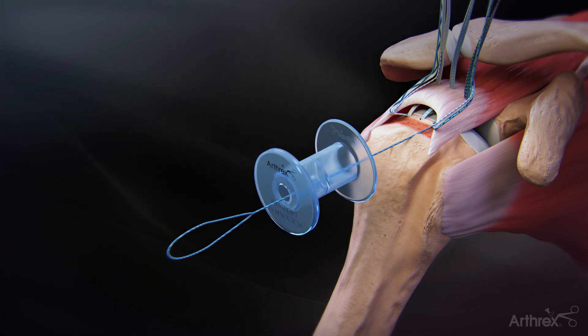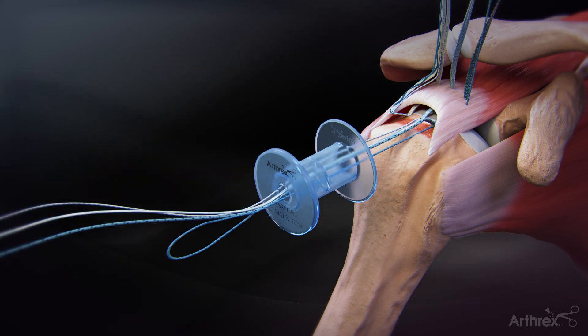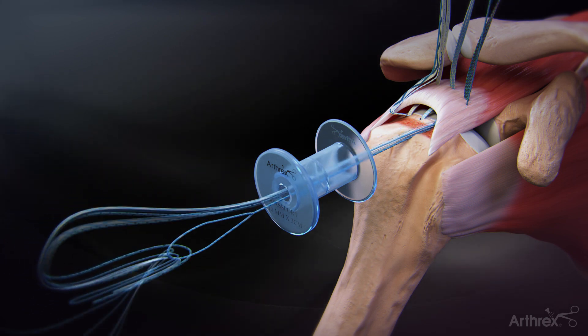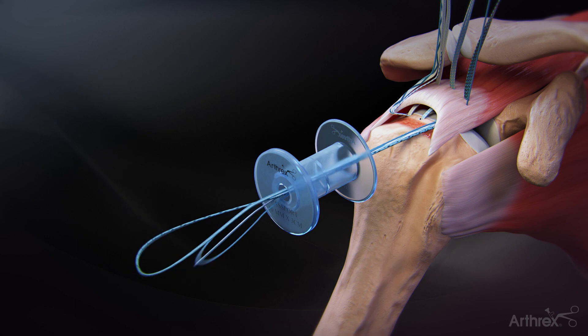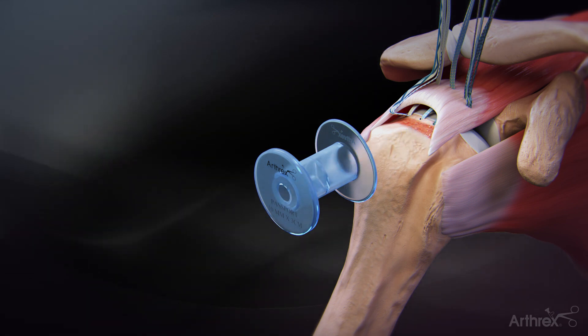Retrieve the three sutures of the tensionable knotless mechanism from the anterior fiber tack through the lateral portal. Load the sutures through the loop of the fiber link shuttle suture and pass the fiber link suture through the rotator cuff, leaving the sutures parked out of the anchor insertion portal.